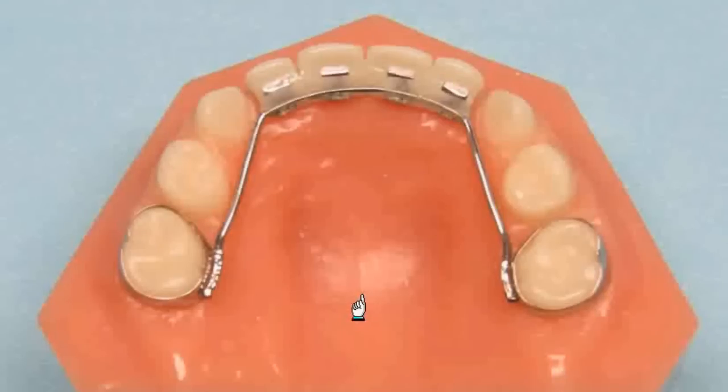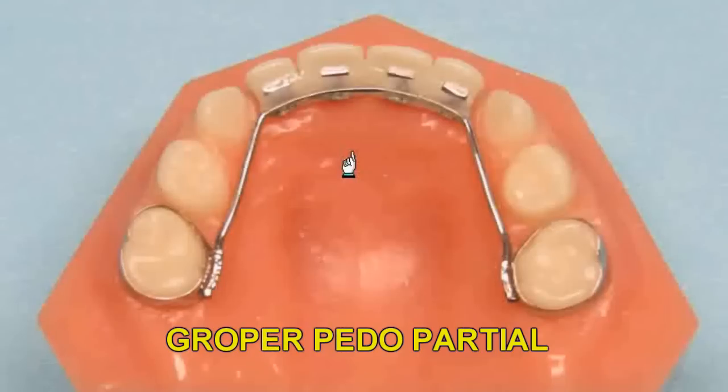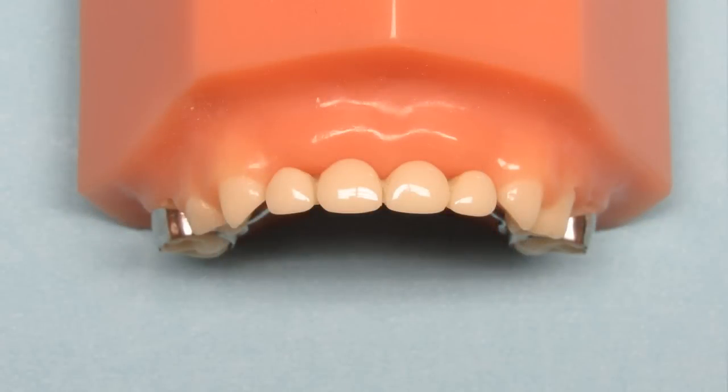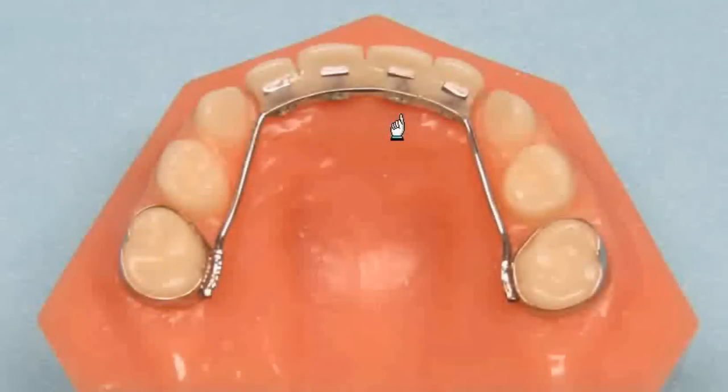Maintaining space in the anterior can be as important as maintaining space in the posterior. The premature loss of a central or lateral can cause as much of a problem, if not more, than the loss of a cuspid or molar. A very popular way to maintain anterior space and improve aesthetics is the Groper Pediatric Anterior Bridge. This appliance can be anchored on the deciduous molars or the first permanent molars if they've erupted enough to band. A lingual wire is welded to the bands and a special pad is welded to the wire. We will attach a tooth or teeth to this pad. The pad greatly improves the strength of the appliance and the bond of the tooth to the wire. This appliance can be made to replace a single tooth or as many as six teeth if needed. For this appliance it's very important to send both an upper and lower model along with a tooth shade. The Groper appliance is an excellent appliance to maintain anterior space and improve the patient's smile.